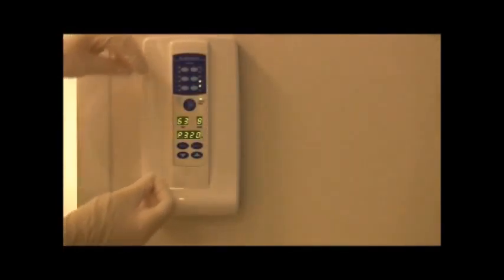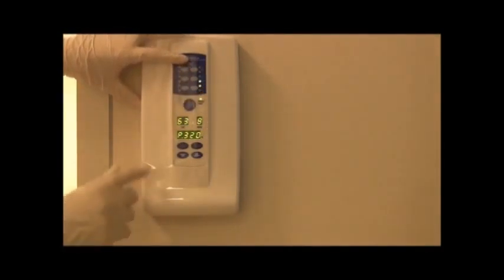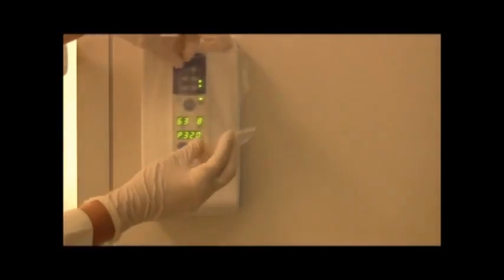In order to follow proper infection control procedures, make sure that your X-ray tube head is covered with the appropriate barrier bag. In order to follow proper infection control procedures, be sure to cover the control panel with the appropriate barrier.